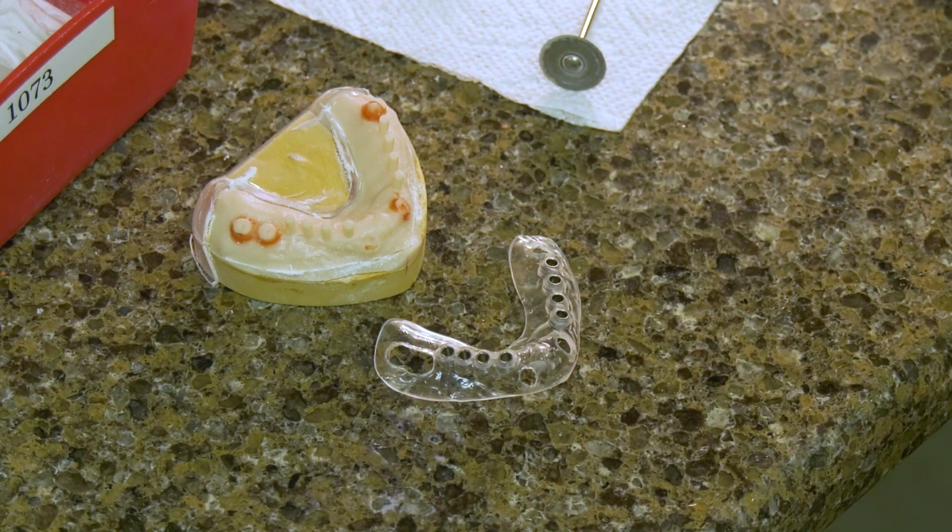And we can do it from anywhere from one tooth to a whole arch of teeth, for an upper denture stabilization or a lower denture stabilization, or a roundhouse bridge. By doing that, we're also able to fabricate a restoration that would go in the patient's mouth on top of the implants in a precise, pre-planned position, whether it's a single tooth, multiple teeth, a denture, or a bridge. And in rare cases, we might even do a roundhouse bridge in one visit using a surgical guide stent with 10 to 12 implants. But usually, we make a temporary bridge to place at that time so that you can put the implants in, take your final impression, and then make your final bridge.